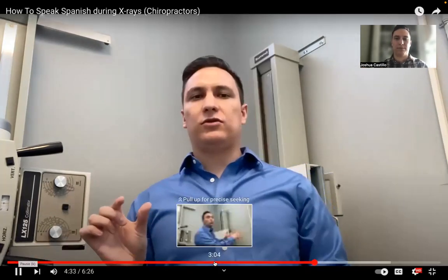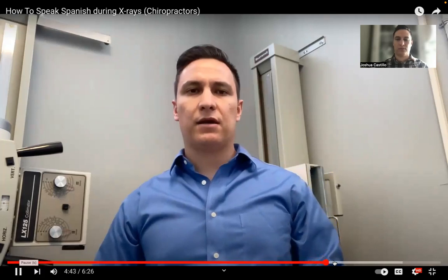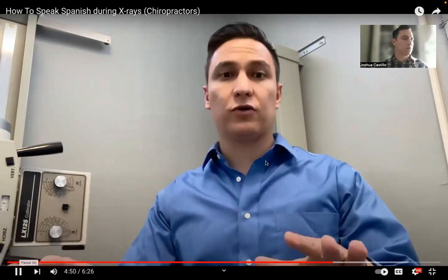This is probably the most important part of the video, guys. For women, I like to tell them what I'm going to do before I do it. Specifically when I'm looking for hip measurements or I want to see where the hips are, where the belly button is, I'm telling them, hey, voy a checar el nivel de las caderas, voy a tocar aquí, voy a tocar aquí. I'm going to touch right here. And then they say, okay, right? Versus if you just go in there and start doing stuff, that might be a little weird.